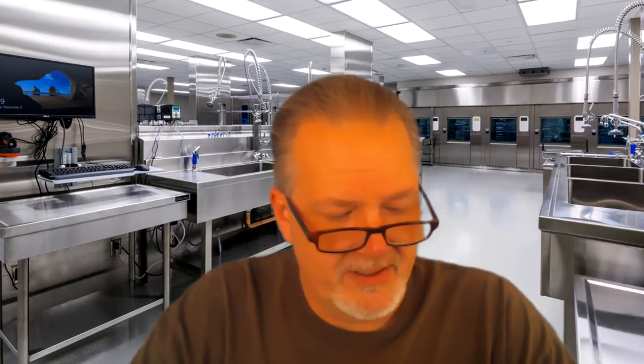So also at point of use, they should empty the fluids from containers, like the suction containers or basins that have sterile water in them, perhaps some instruments soaking in bloody water. These are common sites to see returning to the decontamination room, but water in a container like this should not be sent out to the decontamination room. It should be disposed of at point of use.